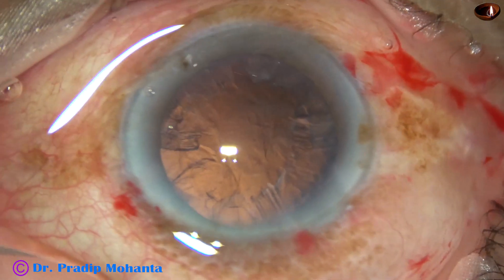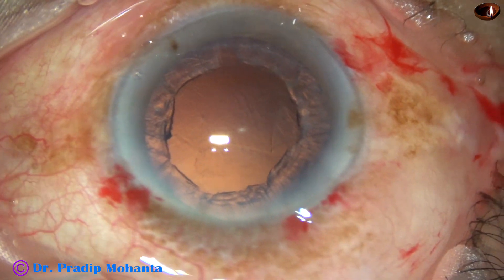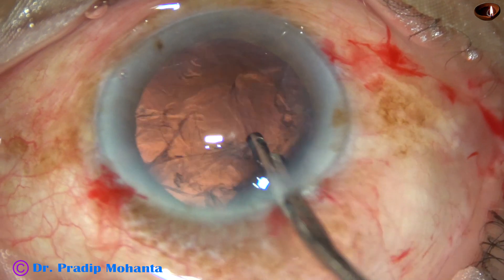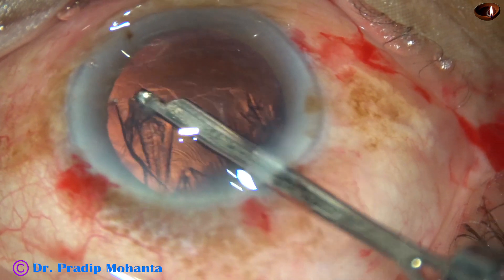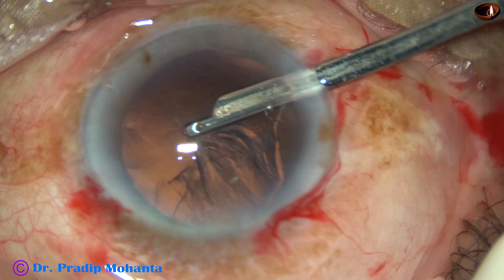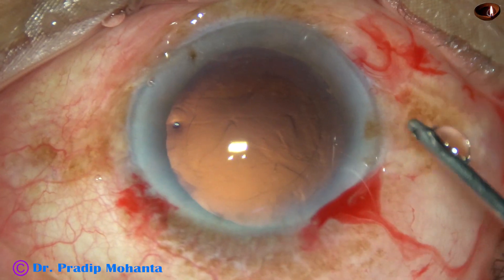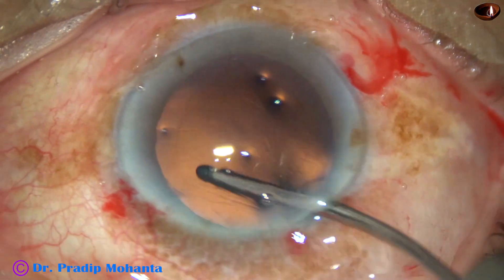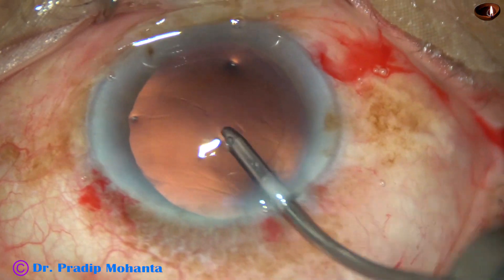Then some amount of viscoelastic is injected. And see how you can use a 23-gauge Simco to remove the cortex — just use enough vacuum to pull this cortex to the center and aspirate when it comes to the center. Use vacuum to pull at the center, and after it comes to the center, apply more vacuum to aspirate. And this is hydro-polish. The posterior capsule is very nicely cleaned.